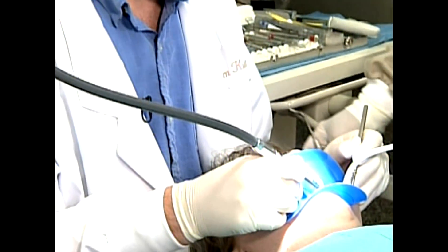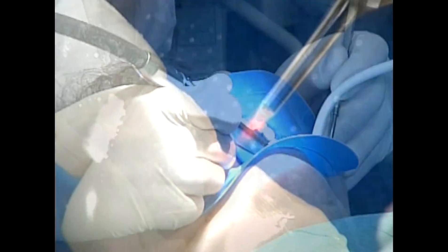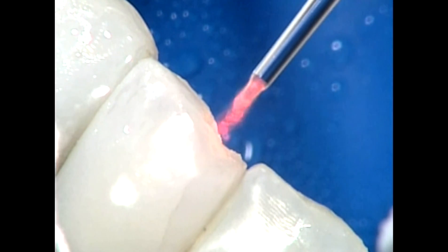A new laser dentist should introduce anesthesia-free procedures only after they have mastered laser settings, cutting, and all basic technical skills related to laser cavity preparations.